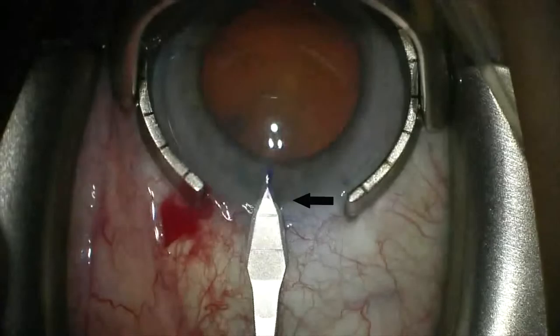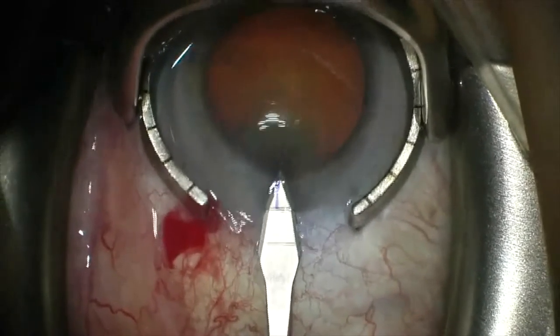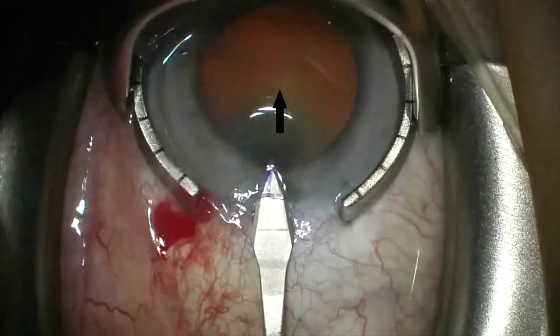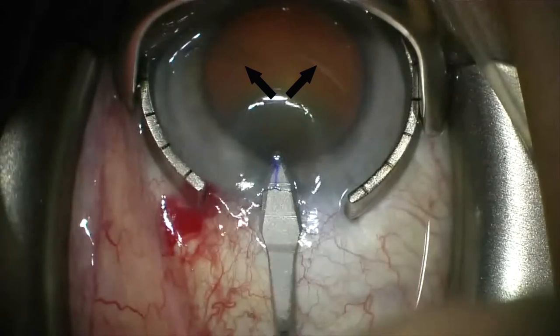Optimal wound construction requires two essential steps. The first is eccentricity: initiate the corneal incision just inside the limbus. This will facilitate peripheral access of surgical instruments and prevent any interference of the gonio lens when placed externally. The second step is location of the corneal incision. Entry along the 3 to 9 o'clock plane will provide equidistant access to the nasal angle superiorly and inferiorly.